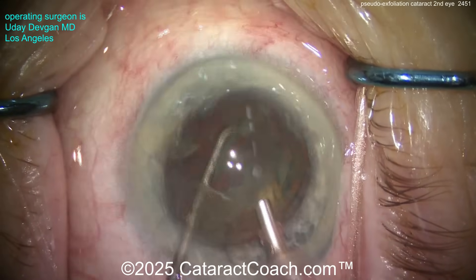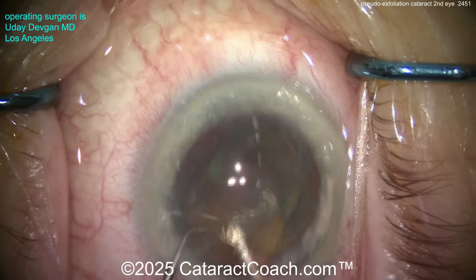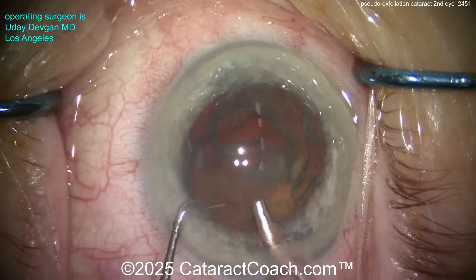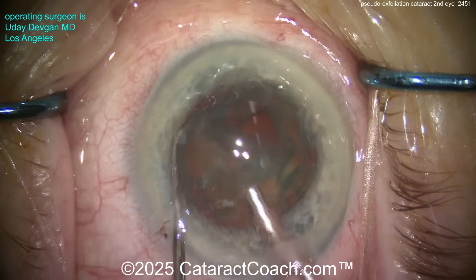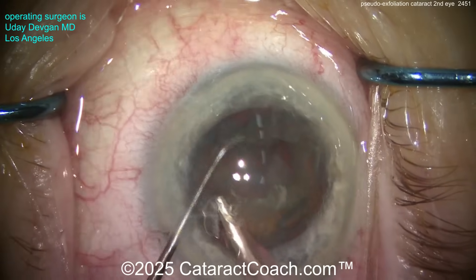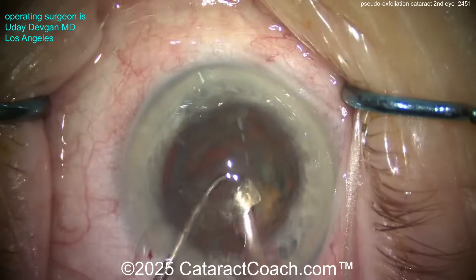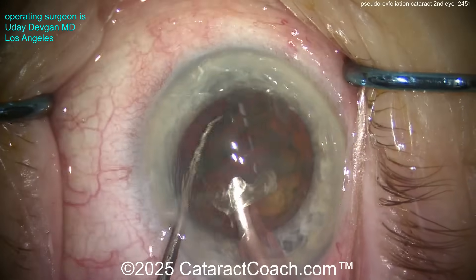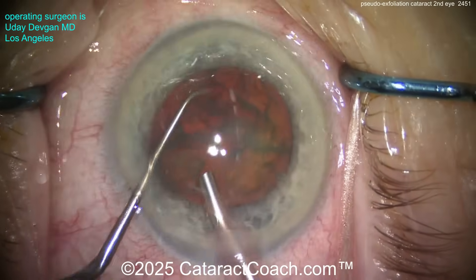Now, what else should you do in this case? Should you put in a capsular tension ring? Having a CTR in the bag can certainly help with the issue of phimosis. The patient's other eye had surgery — let's say 10 years ago — and has a little phimosis, and we stopped that with a YAG laser capsulotomy of the anterior capsule rim. Should I put a CTR in this eye also to help prevent the phimosis? That's a pretty reasonable option, a reasonable approach. Let's see what I do in this case.